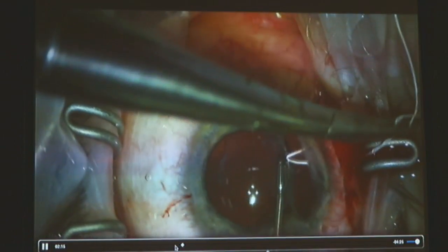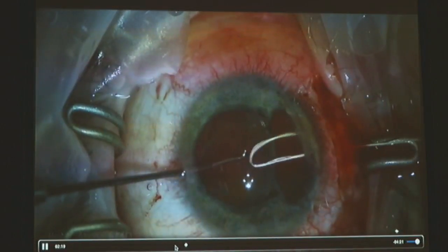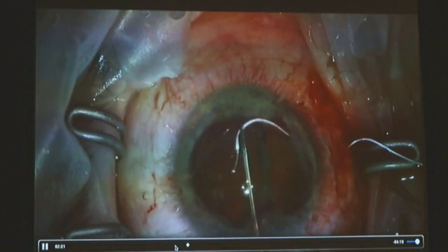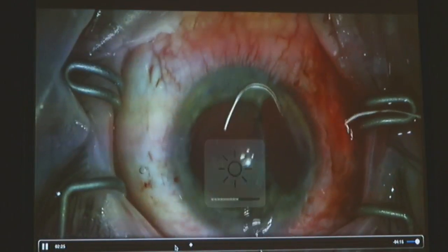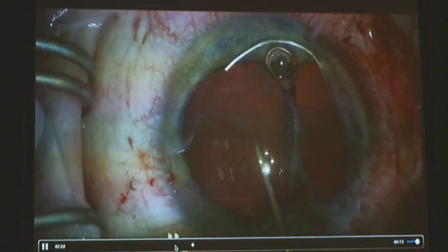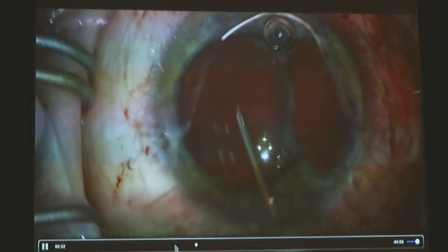So, look, I cannot use it now. So that sucks. So I said, okay, let me take it out. Let me leave the suture in there. What am I going to do? How am I going to fixate the capsular bag there? Well, what's my favorite thing to do? Posterior capsular access. Why? Well, watch what I'm going to do.